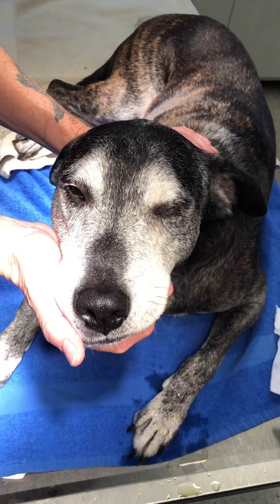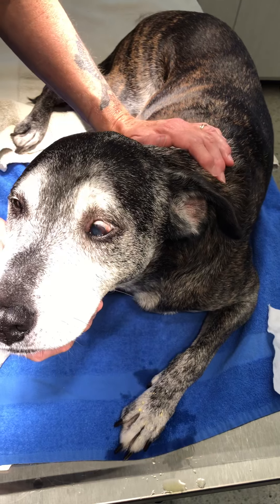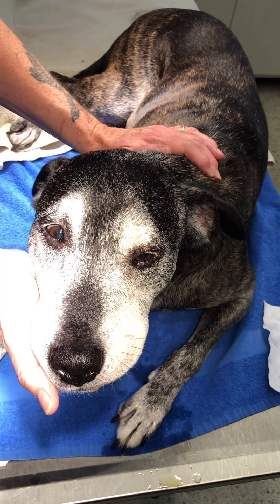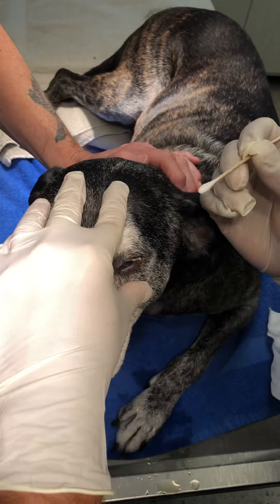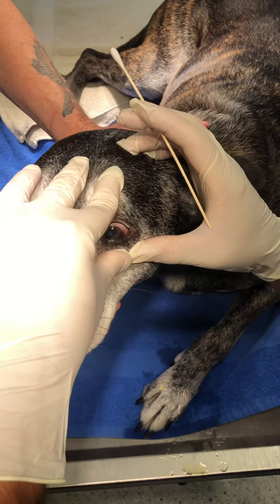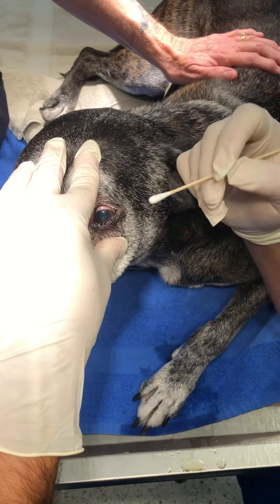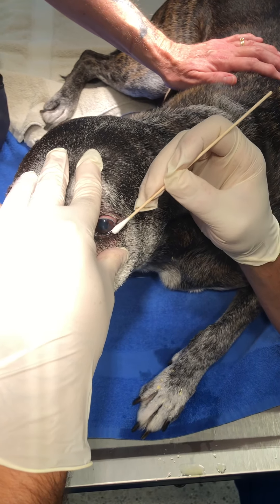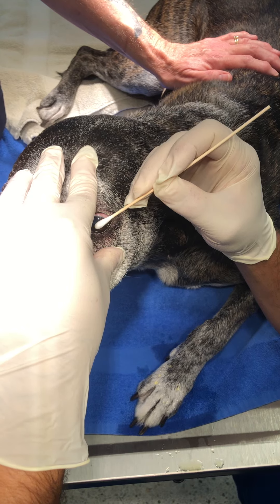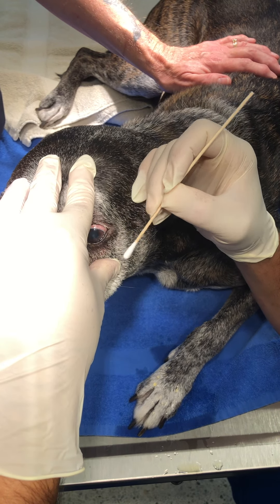To avoid contamination, with a sterile Q-tip we're going to try to remove some dead cells from the cornea in the area that is being affected. The Q-tip has to be dry. As we remove the cells, you can now see the edge of the cornea a little bit better.